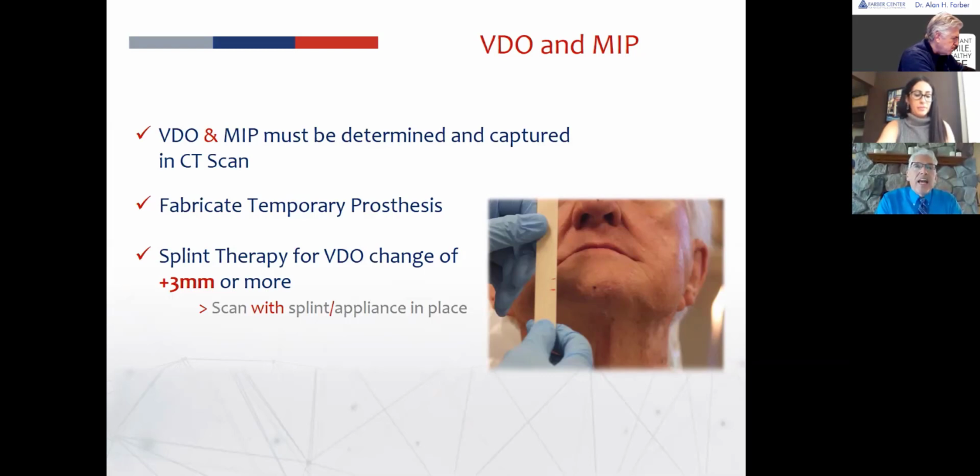The reason for that is that even though we're making you a provisional, we are actually going along the lines that this is the final. We are dictating to Dr. Farber where the implants are going to go as far as depth, rotation, position, angulation, and all that through our guides. We're going to dictate to you as a restorative clinician as well where the cylinders are going to go, where the prosthesis is going to seat, etc. So we need to have this data worked out. If you don't do this, you're going to have a lot more challenges. It'll work, but you're going to be back to almost doing it conventionally, where you have more variables, more modifications, more chair time. So I promise you this, my friends, everything I'm sharing with you, I've done probably 120 plus nSequence full arches.